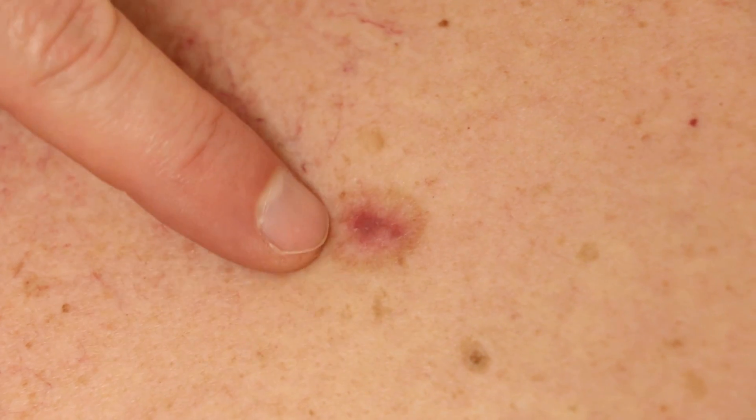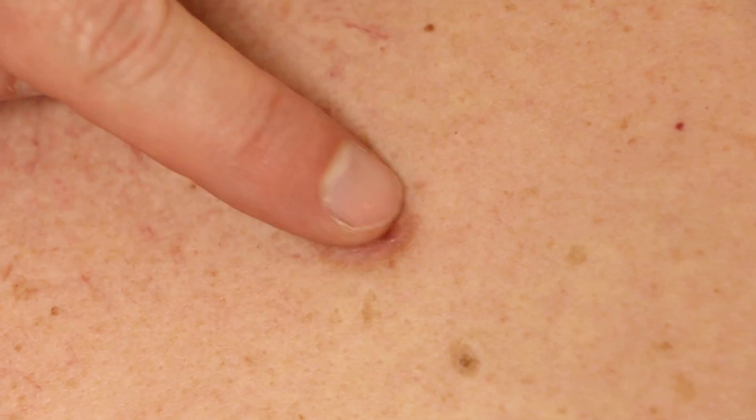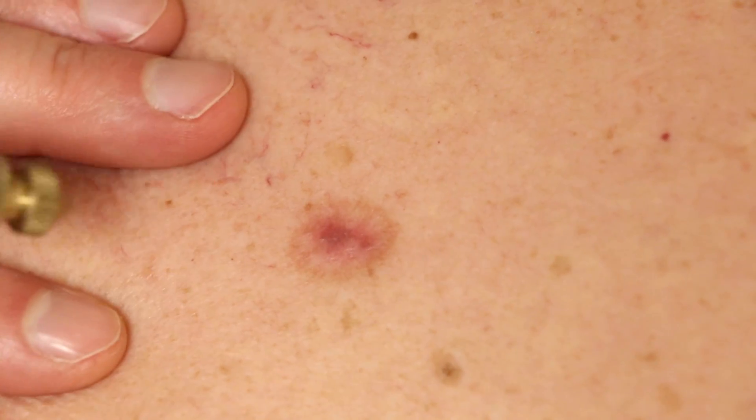So we're going to get that taken care of. What you see here is where he healed in from the shave, but this bump that I can feel when I run my finger over it — that is potentially the cancer going back. So we're going to use the large tip on the liquid nitrogen can here, the little cryo gun, to spray a stream on that. We're going to hit it pretty hard, because we really want to get rid of this.